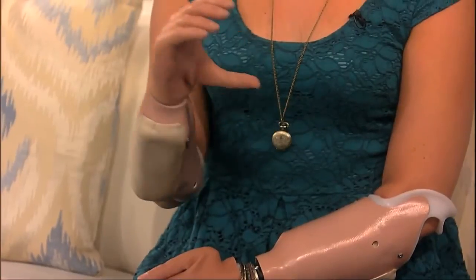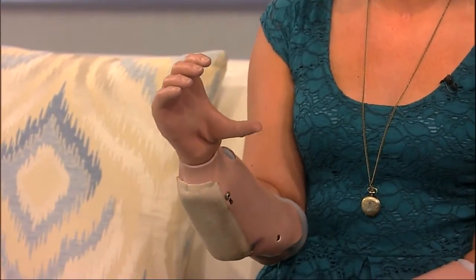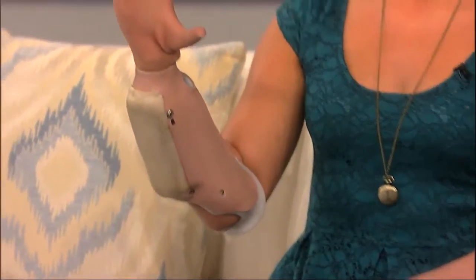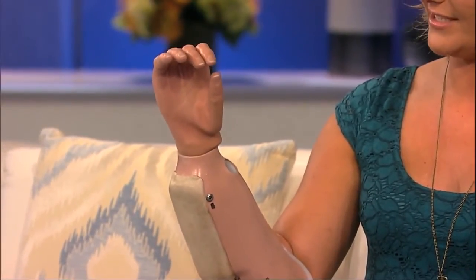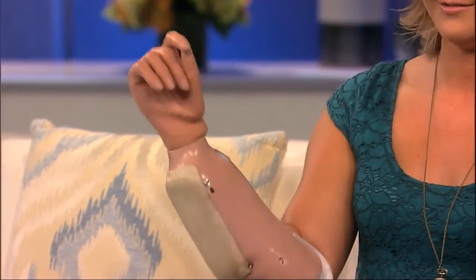When I bend it backwards, it sends an open signal. And it's proportionate, so I can send a small signal or a large signal, and the hand closes proportionally to the signal I give it. So if I bend my wrist forward, it gives a close signal — I can do it slow or hard, and it goes right down.